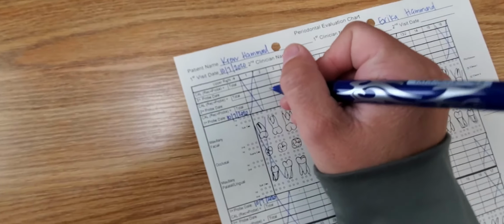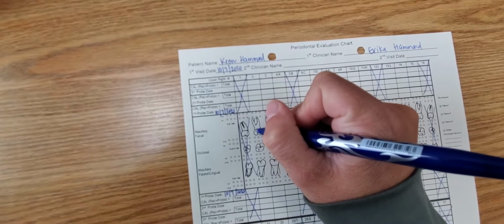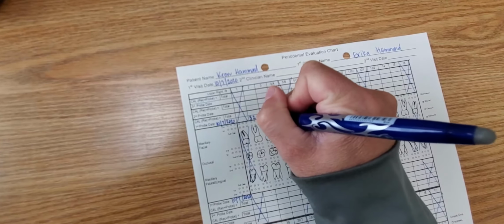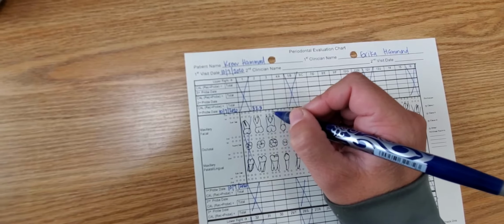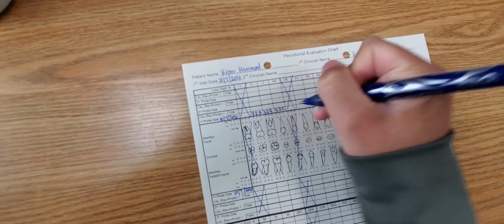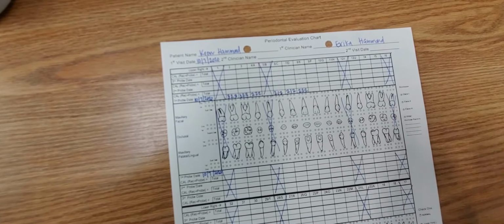So if you say, I'm going to begin tooth number 2, distal buccal, and then you'll call out your numbers. You should try to call those out in groups of 3. As you probe, you'll probably be probing, we'll just say 3, 2, 3, but you want to call out 3, 2, 3. That makes it easier so that the person charting for you always knows which 3 numbers go in which box. So let's say we started on tooth number 2, we're now on tooth number 3, distal buccal, 3, 2, 3, 2, 2, 2, 2, 1, 2, 2, 1, 2, 2, 2, 2, and you just keep moving.